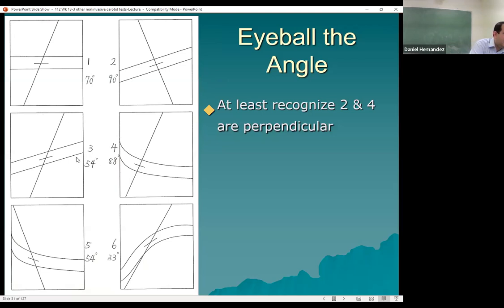So again, we want to try and be around 60 degrees, less than 60 is okay. This one is closer to 70 degrees, so that's not a real great Doppler angle. We would have to steer a little bit more and come at it at a different Doppler angle. So I want you guys to recognize when our scan line is perpendicular to our vessel, that's not a good Doppler angle. That was not going to give us any sort of Doppler shift.